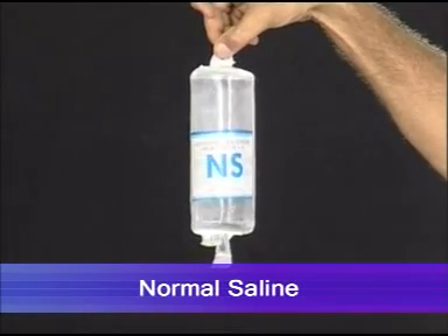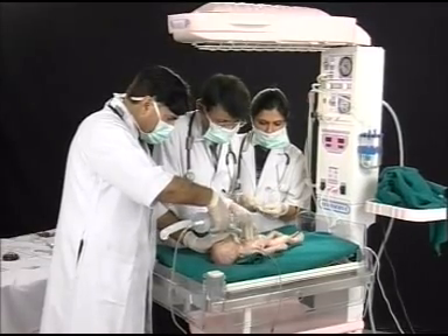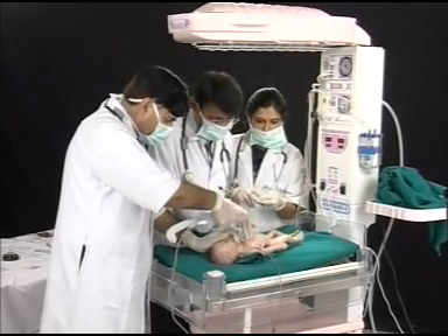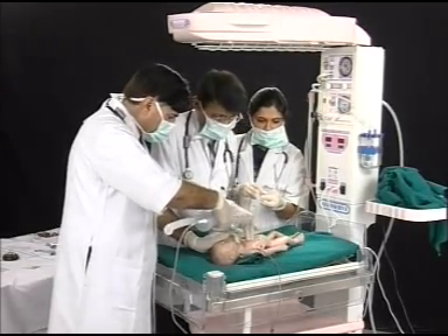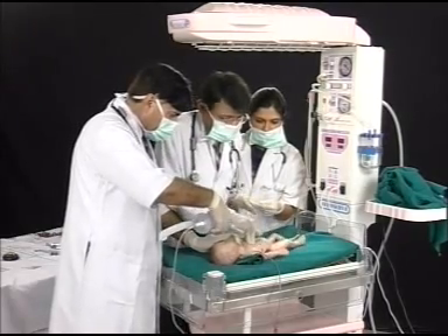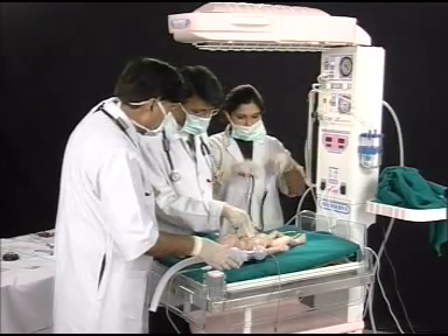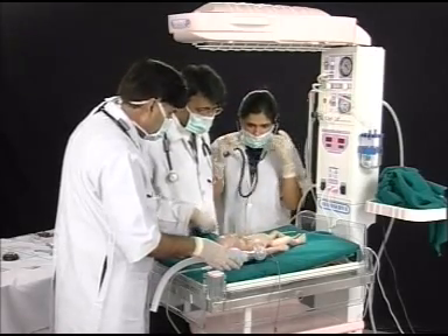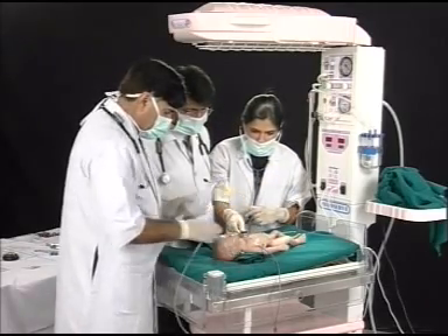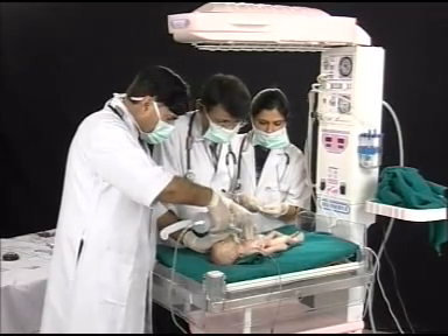The plasma expander used is saline. The dose of saline is 10 to 20 cc per kilogram, and it is administered through the same umbilical cannula slowly over a period of 5 to 10 minutes. Generally after giving the plasma expander, the baby's circulation improves, the baby's acidosis gets controlled, and the baby starts showing improvement. Bag and mask ventilation and chest compression are continued until the baby's heart rate is more than 100 per minute.